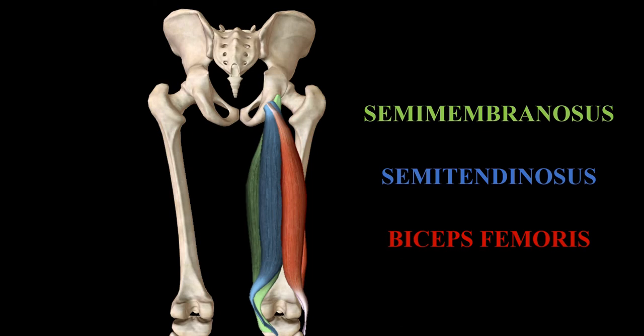So you might see a greater extent of hypertrophy nearer the origin or nearer the insertion. And this has been shown. So it's an important point to consider when assessing the activity of long muscles, essentially, like hamstrings and some of the quadriceps muscles.